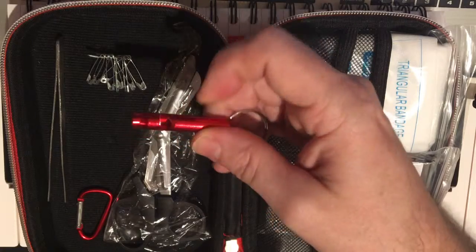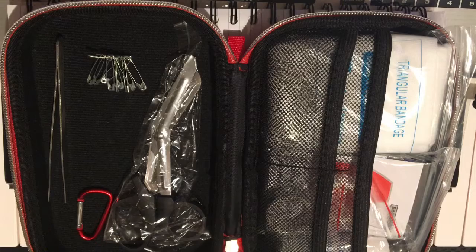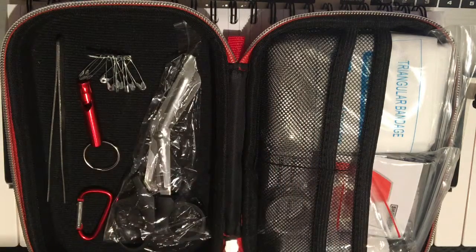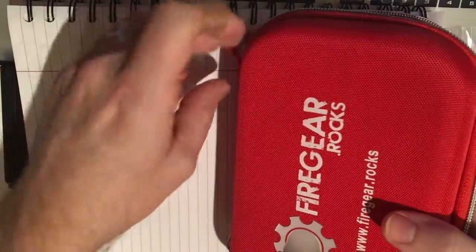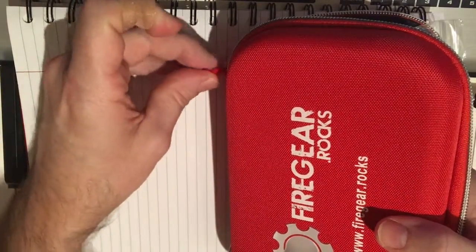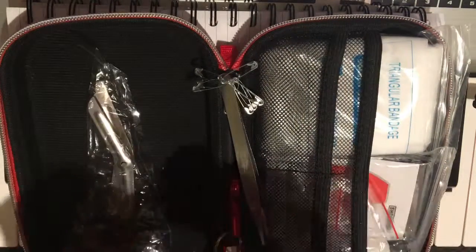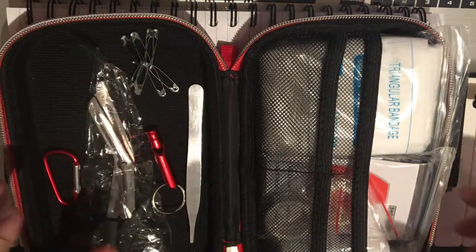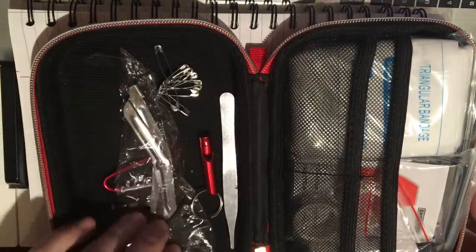A little survival whistle here — I like this, it's aluminum. Give it a quick blow. Okay, sounds pretty good. This carabiner is designed to attach to a little tag on the case so you can clip it to your bag. If you put this on the back of your bag up high, that big red cross symbol would give you some nice visibility as you're hiking along, if that was your goal.